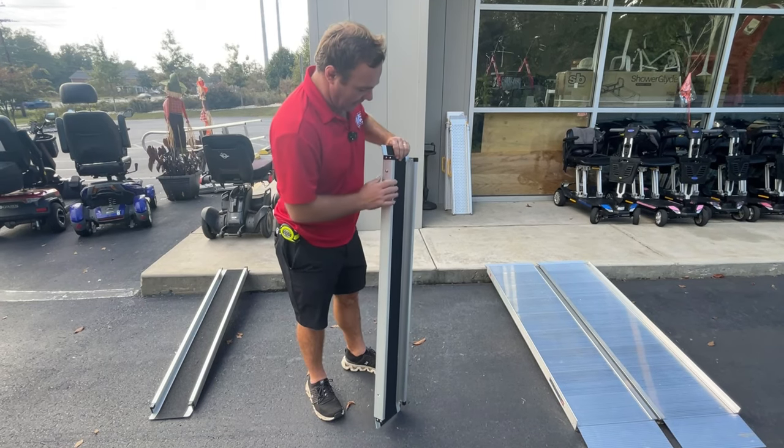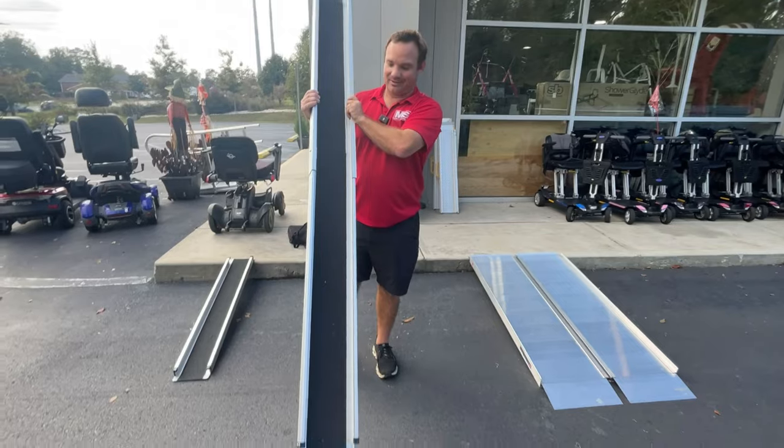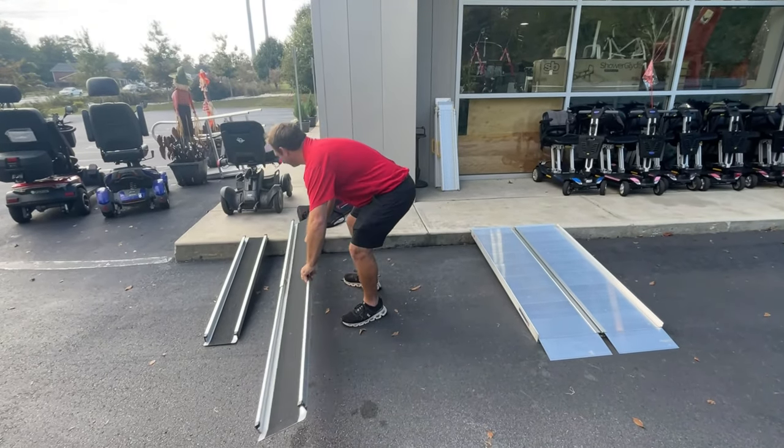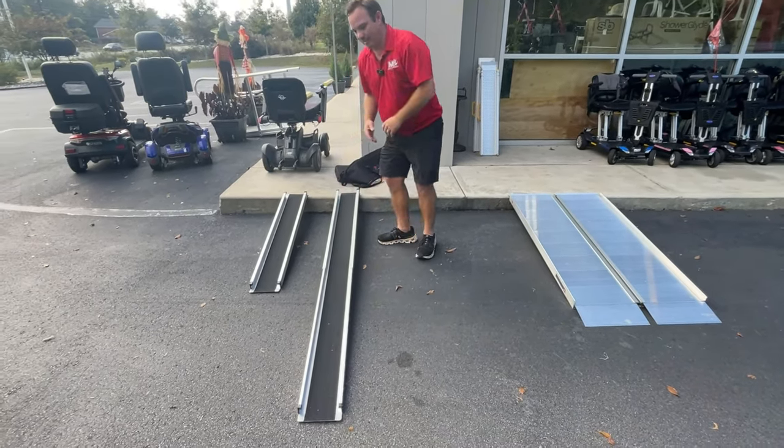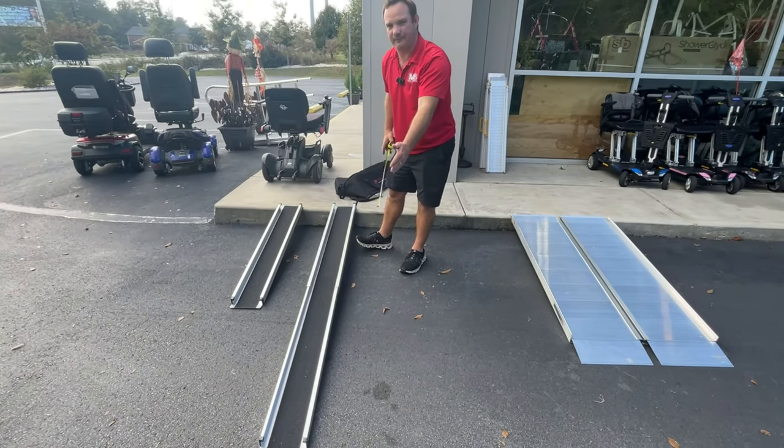You can unfold this out — just telescope it out just like that — and then rest it however you want. That's about seven feet, so four feet when you have it folded up to seven feet for a longer distance.